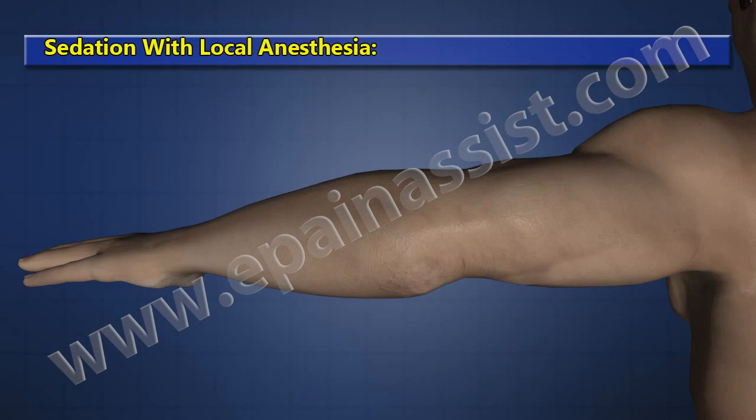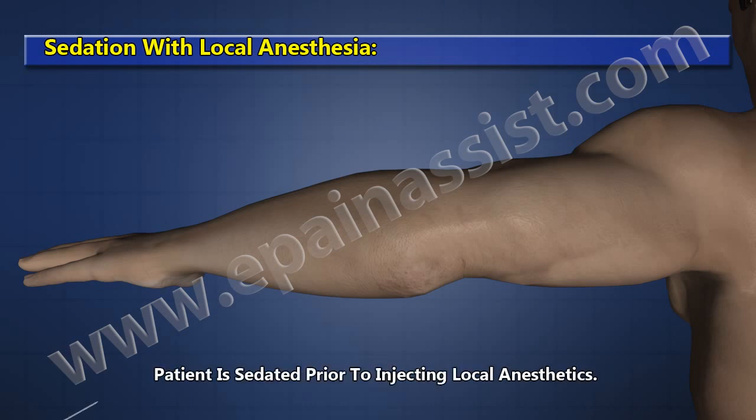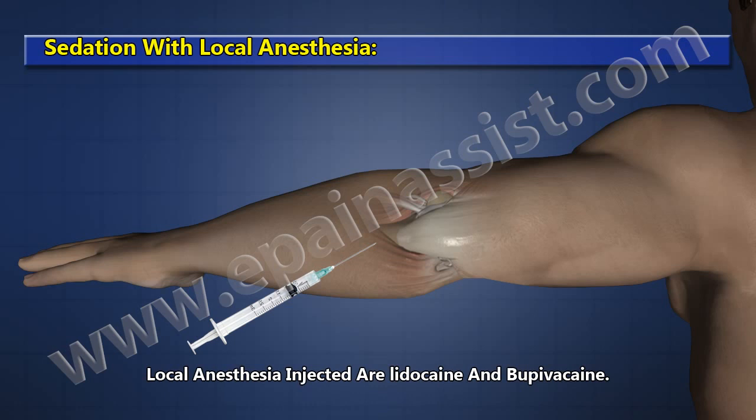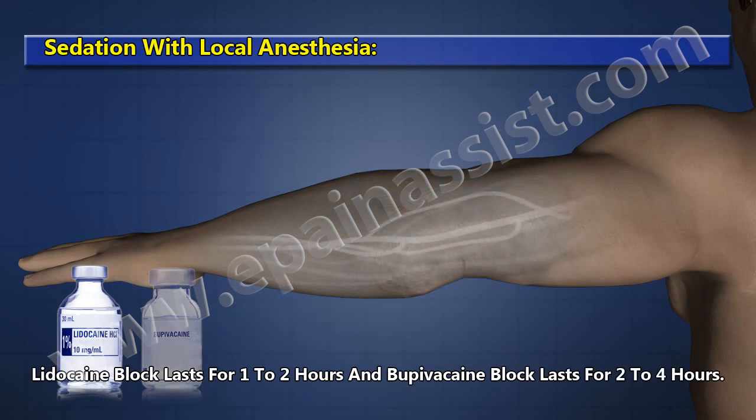Sedation with Local Anesthesia. This procedure can also be performed under local anesthesia. The patient is sedated prior to injecting local anesthetics — lidocaine and bupivacaine. Lidocaine block lasts for 1–2 hours, while bupivacaine block lasts for 2–4 hours.